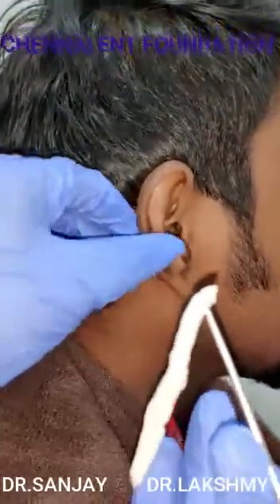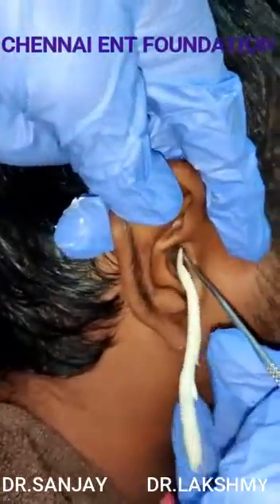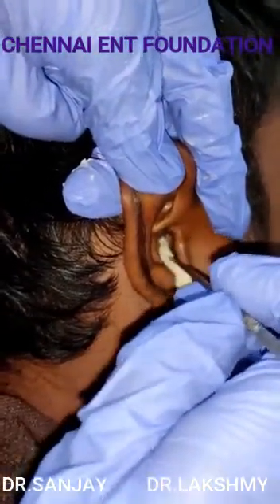Once you go near the ear, hold the ear as I've shown you, pull it to either side to widen the ear canal. Keep the ear wick right at the entrance of the ear canal and push using that instrument.